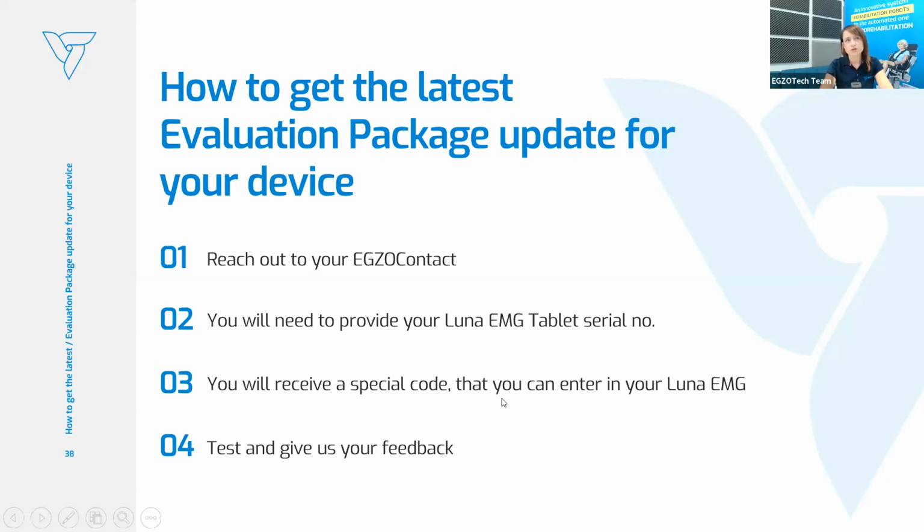And I encourage you to test those tests and give us your feedback, because we still work on them, so they are even better for clinicians, right? So they're not only good from the engineer perspective, but we adjust them to different patients, and with your feedback we can improve this even better, and then we will implement those changes later, and so those evaluation protocols will be great.